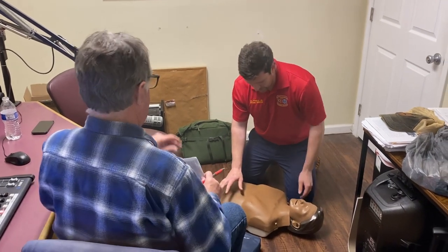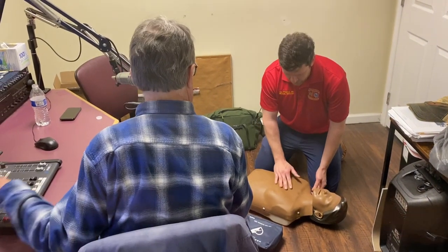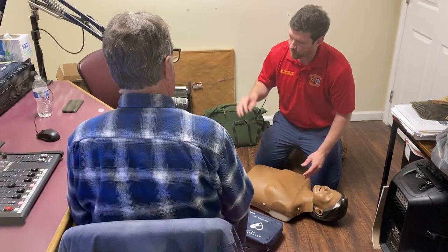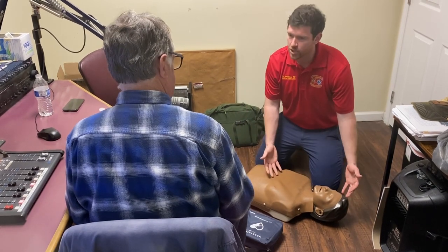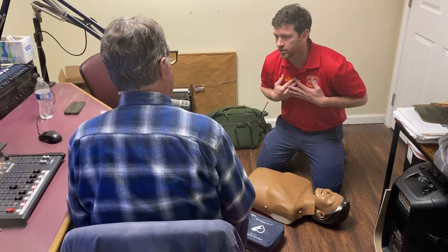So we have an AED machine here too, but we're going to do chest compressions first. I've gotten down and I'm kneeling. He's not responding, and I'm tapping on him. I'm trying to stimulate him to wake up, and I've noticed that he's not breathing normally. So I'm calling for help — taking my phone out of my pocket, calling 911, putting it on speaker. This person is unresponsive and not breathing normally, so I'm going to start chest compressions.